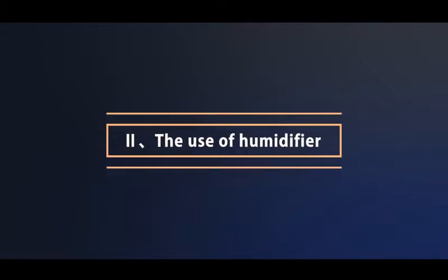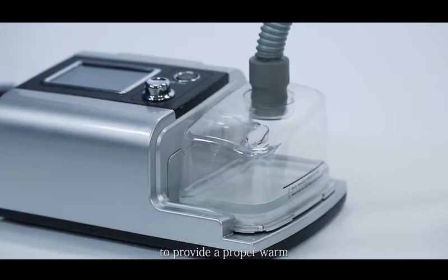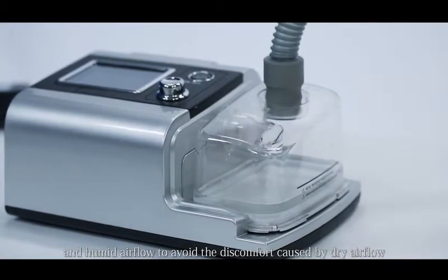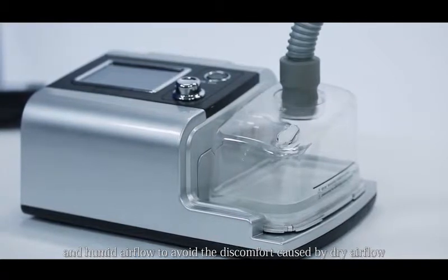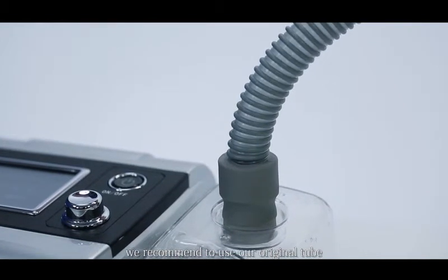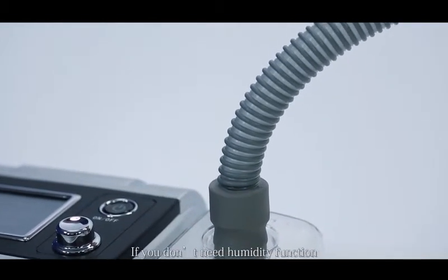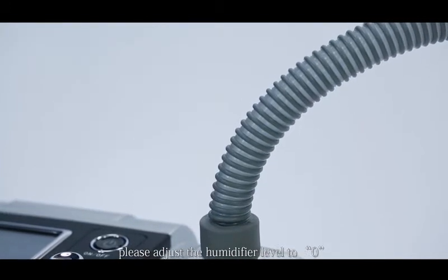The use of humidifier. The humidifier works by heating the water to provide a proper warm and humid airflow, to avoid the discomfort caused by dry airflow. When using the humidifier, we recommend using our original tube to avoid leakage. If you don't need the humidity function, please adjust the humidifier level to zero.